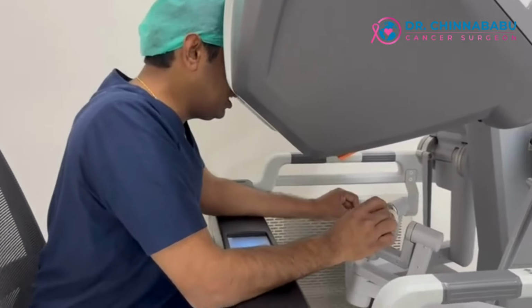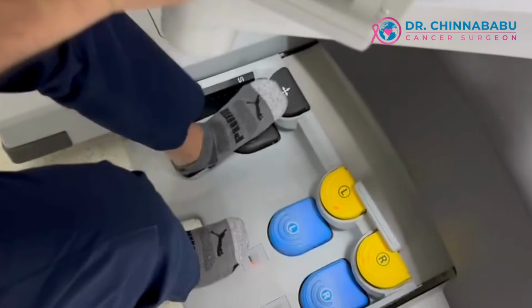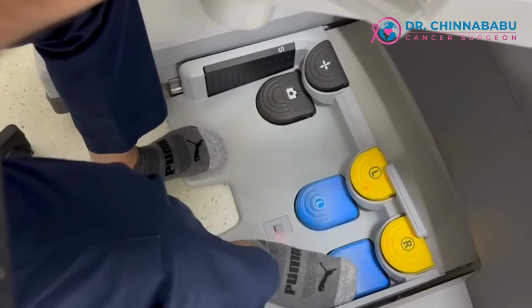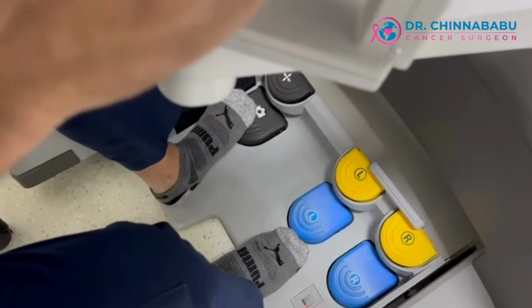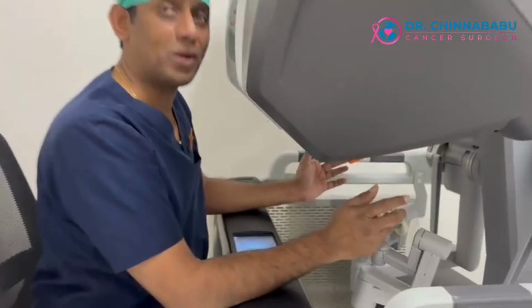Even as you see here, I have the control of the camera with me. I have the control of the focus. I have the control of the forearms. I have the control of the cautery, both cutting and coagulation. So everything is with the surgeon's control. So there is less dependency on the assistant surgeon, unlike in laparoscopy.